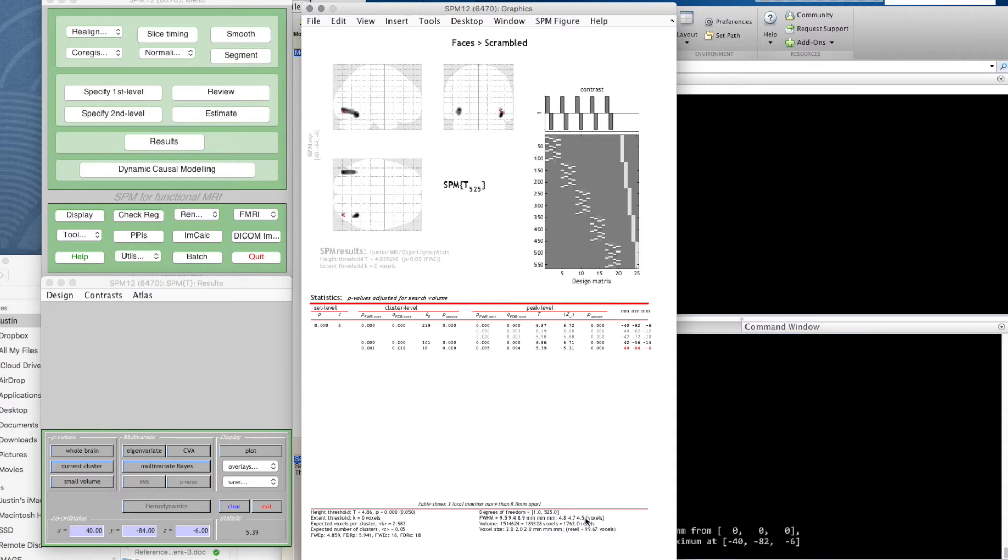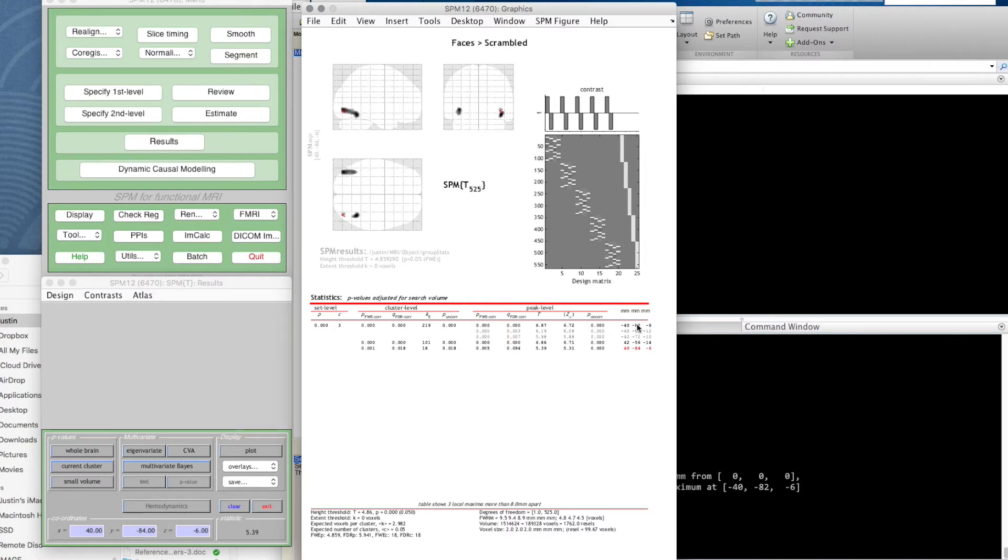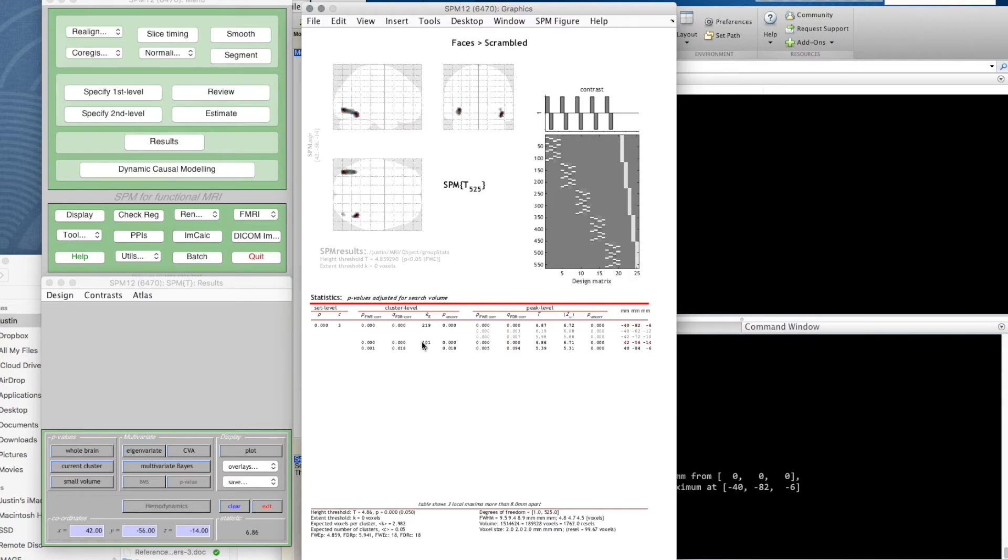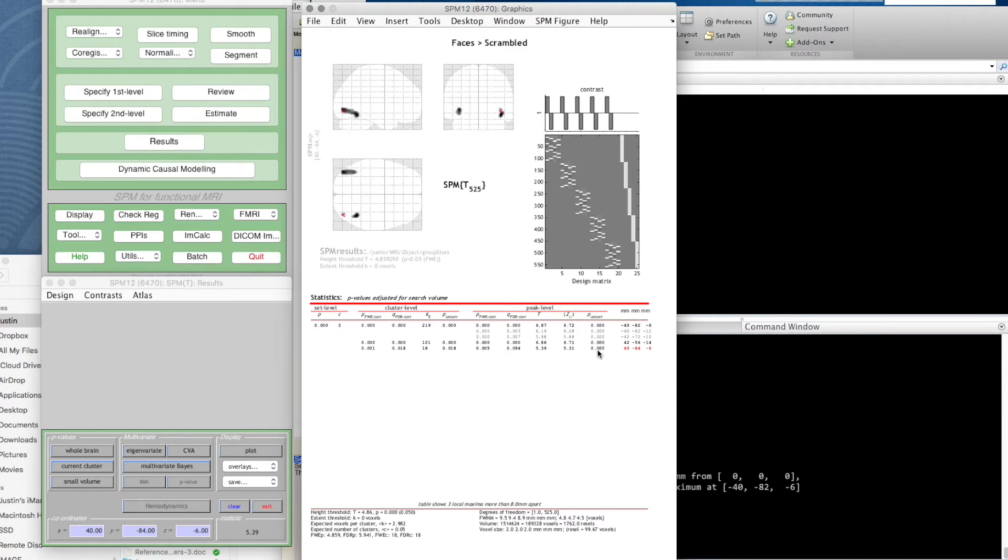We come to our table, and we're mainly interested in the voxel level statistics. It's not showing us every single voxel here, but it's showing us the different clusters. This is a cluster of 219 voxels, and it's just showing us details of the three which have the highest T score in this cluster. We have another cluster of 101 voxels, and another cluster of just 18 voxels. This is the T score, this is what the equivalent Z score is.